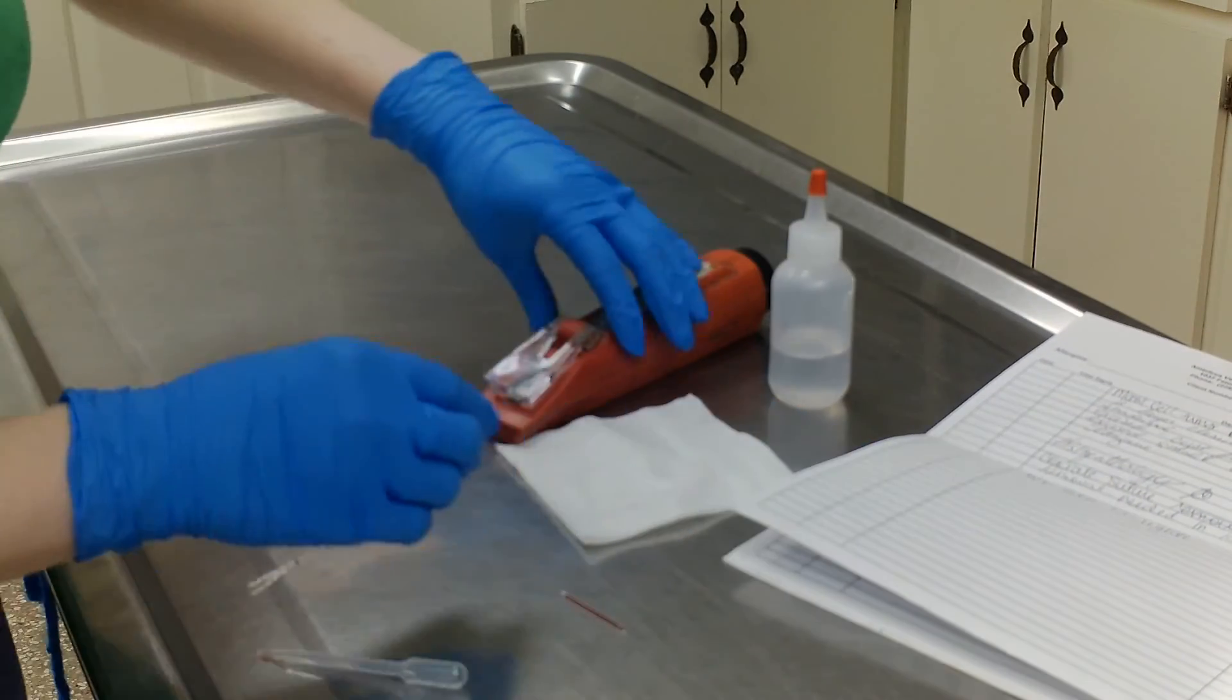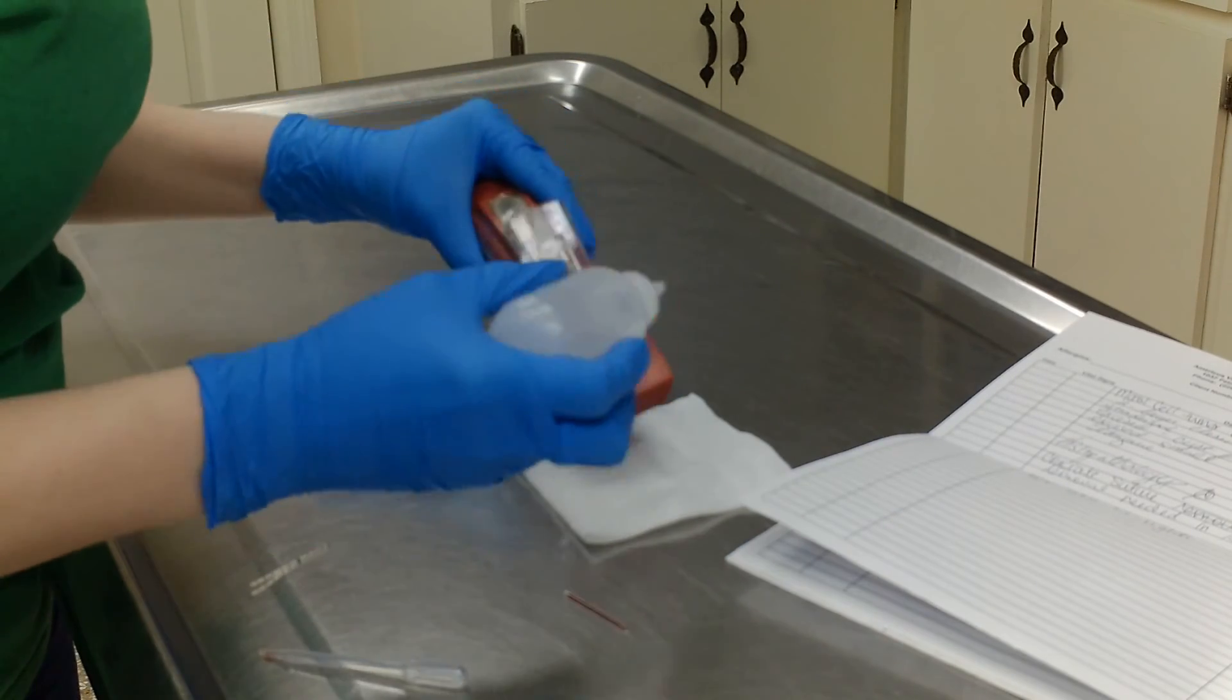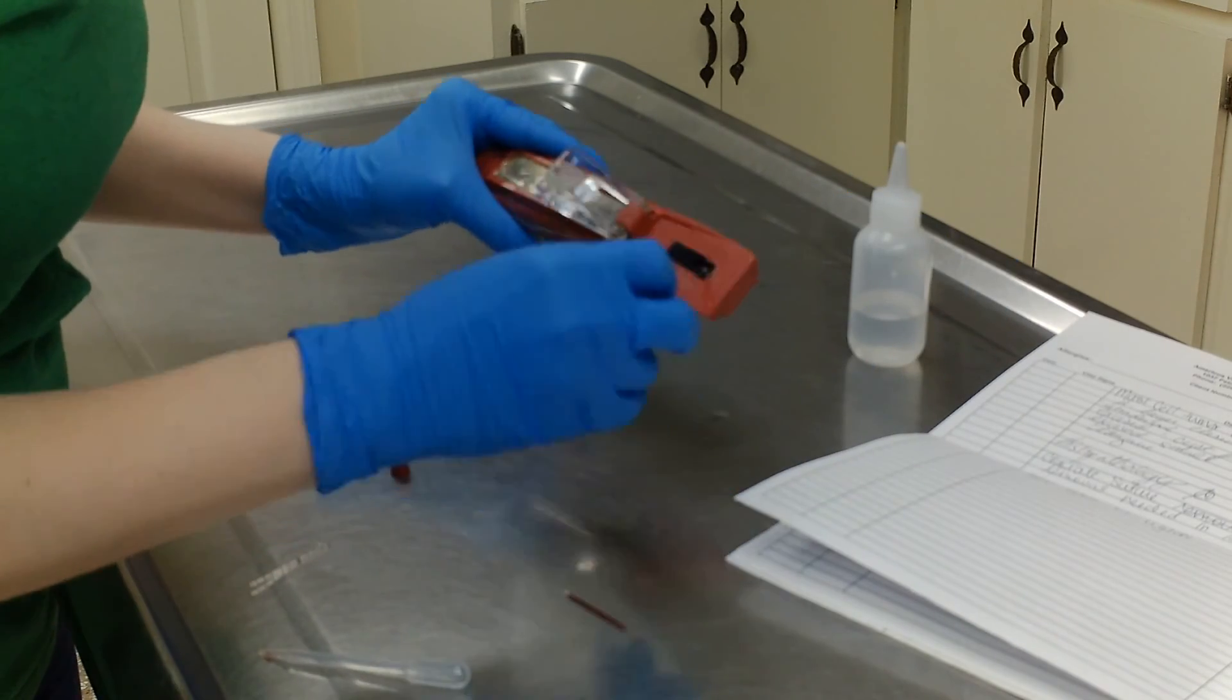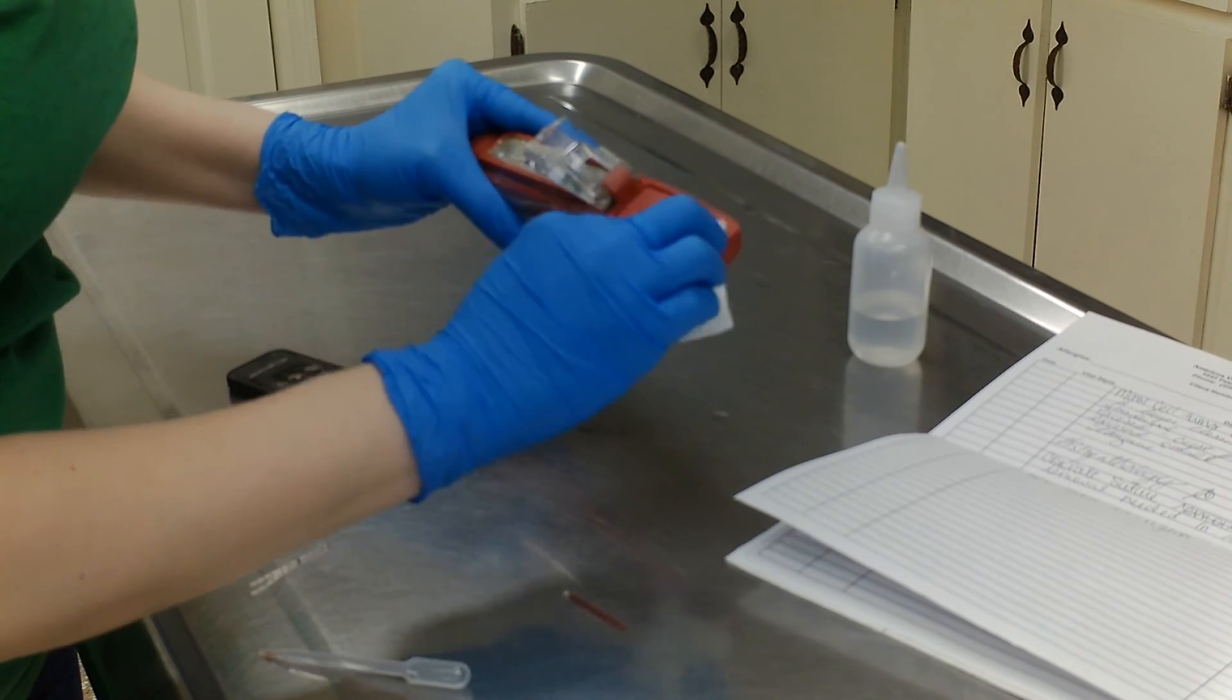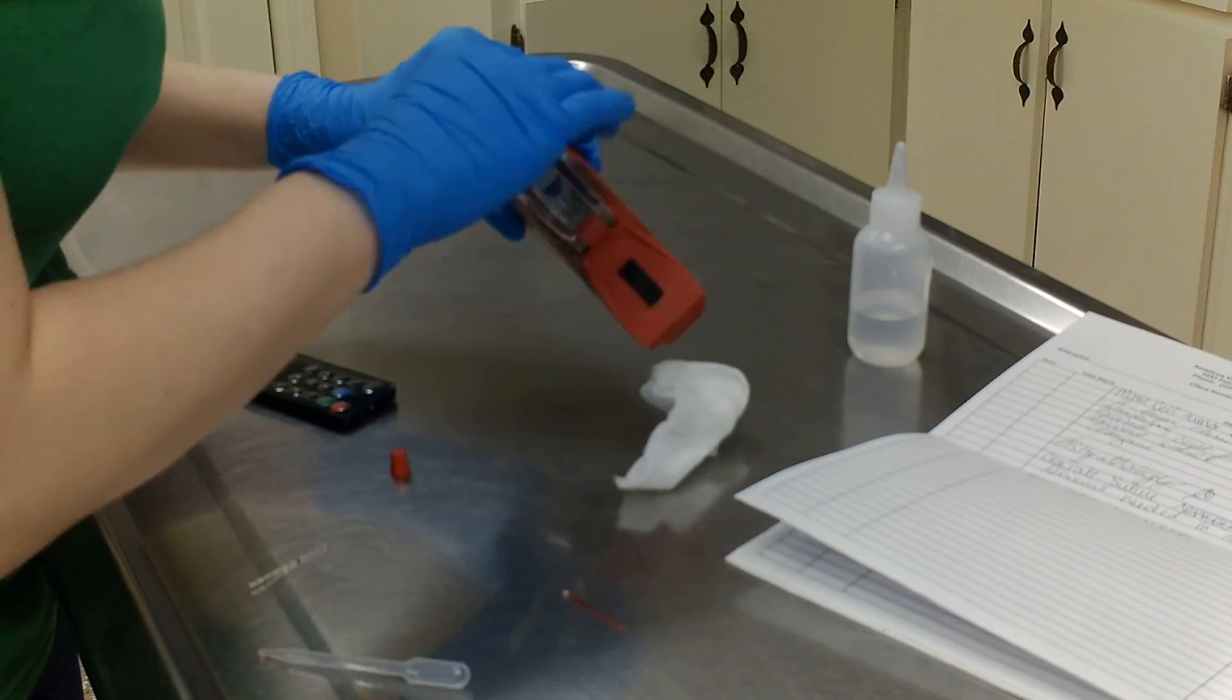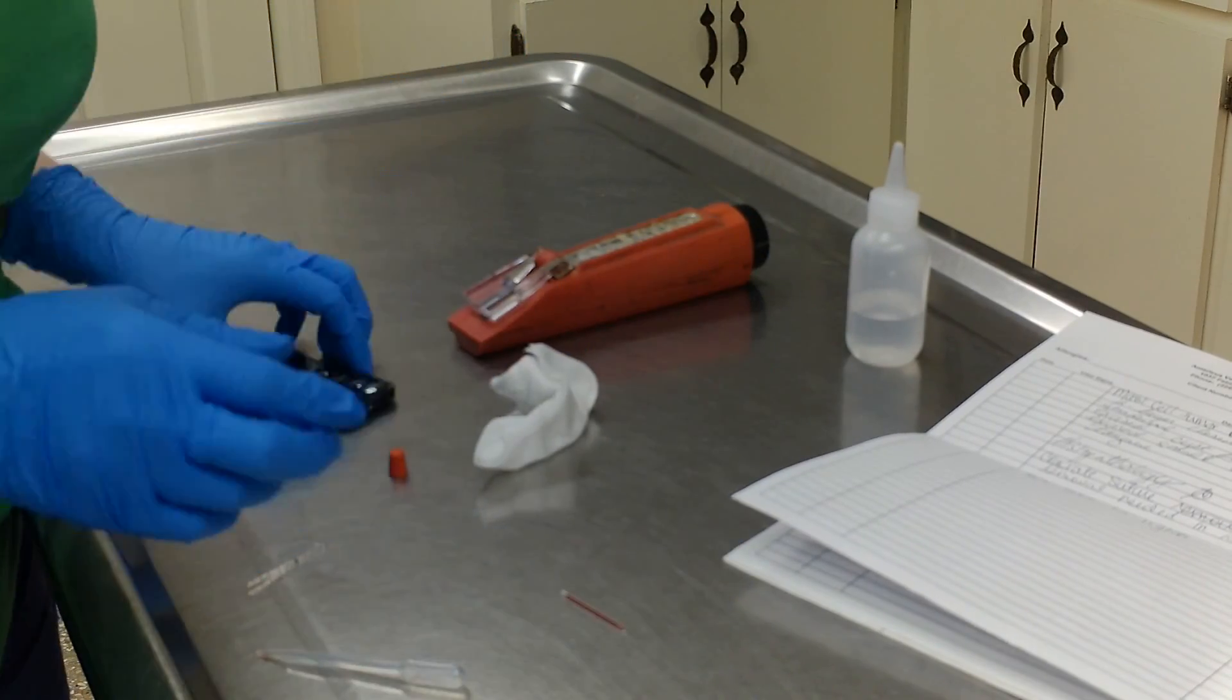Now we're going to clean it off with a little bit of distilled water. Then we're going to wipe it off, and we're going to put everything back where it goes. And that's how you do a PCV and total solids and total proteins. Then we put it into the patient's chart.